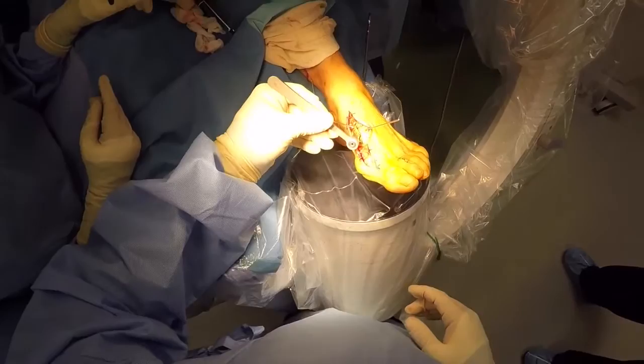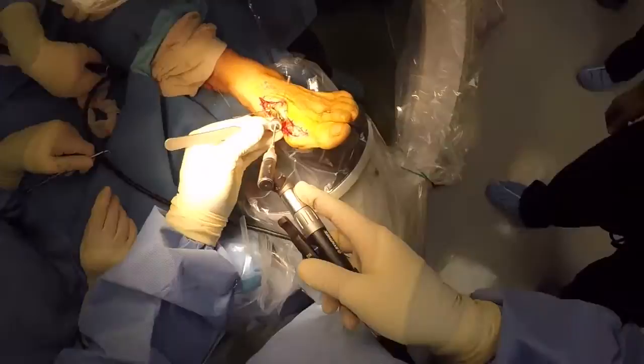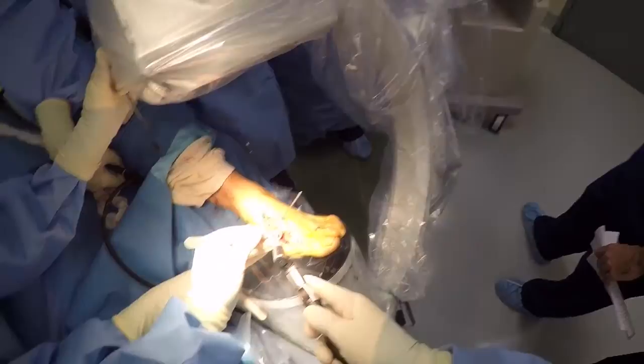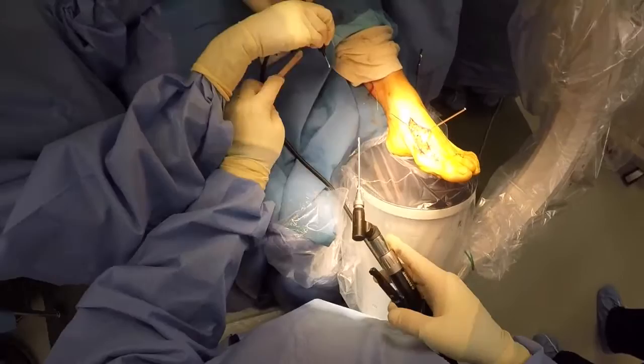This drill sleeve is used for the freehand screw. It sits directly into the divot in the plate and has a U-shaped cutout so it contacts the plate at a particular angle. This is freehand driven, which we perform under C-arm as well, so we know proper depth of the drill. This is the compression screw interdigitated with the plate that will exact compression across your fusion site.